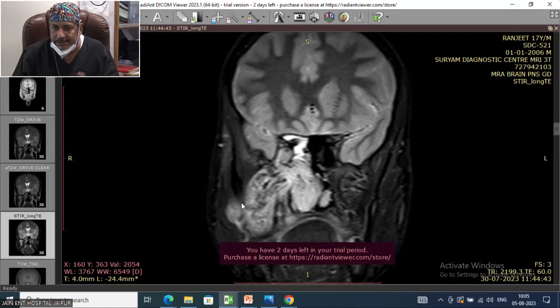Giving antibiotics and steroids to reduce the inflammation of the mucosa. Then more and more coagulation, taking the vascular control, not entering the tumor directly. All these, and adequate exposure, adequate exposure is the key. So you don't need any blood to be kept ready?